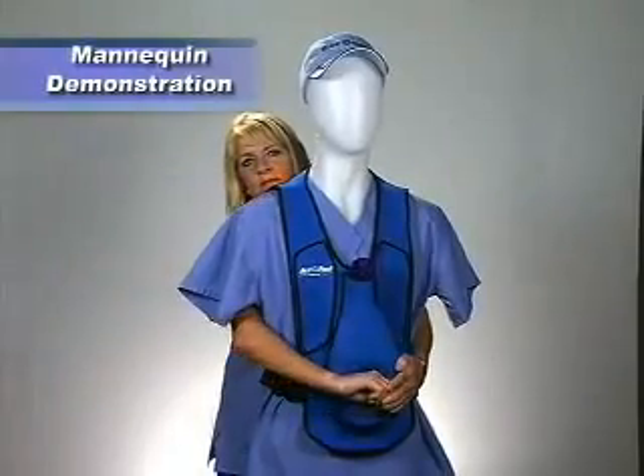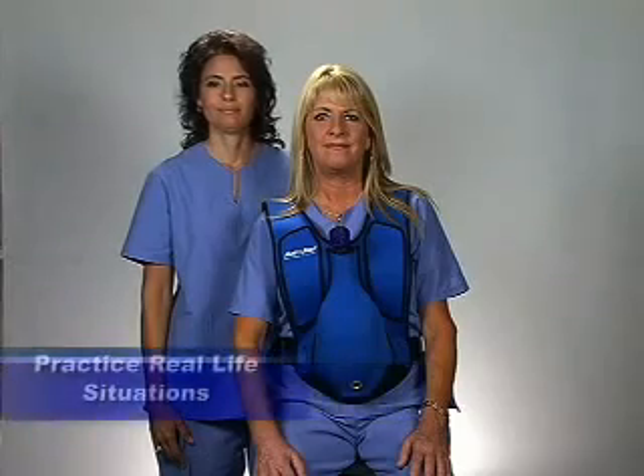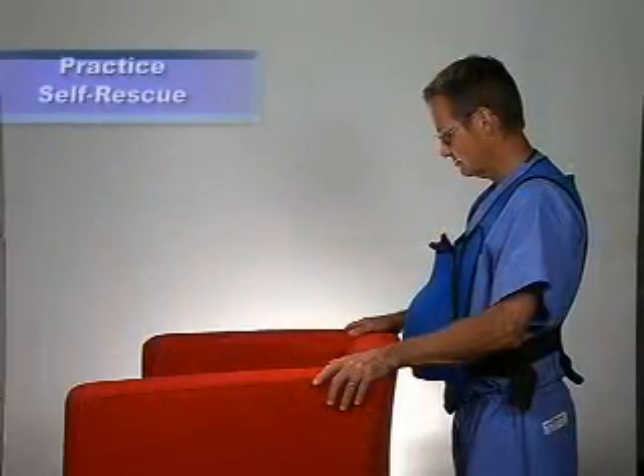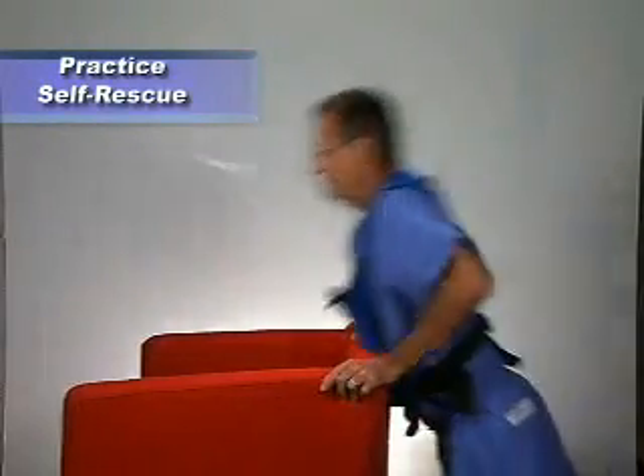The vest can also be used on a mannequin. The training vest allows students to practice the correct technique in other real-life situations, for example, when sitting. Students can also practice self-rescue in case they find themselves alone.